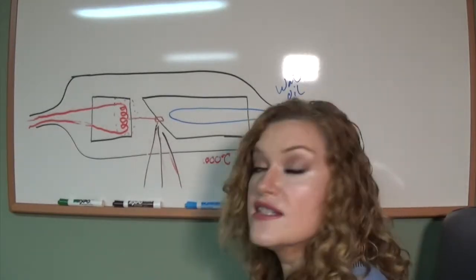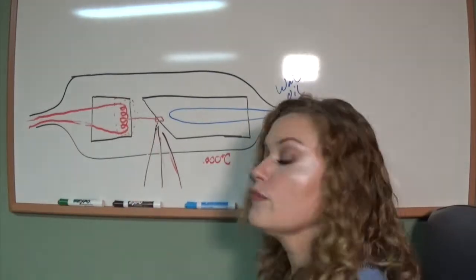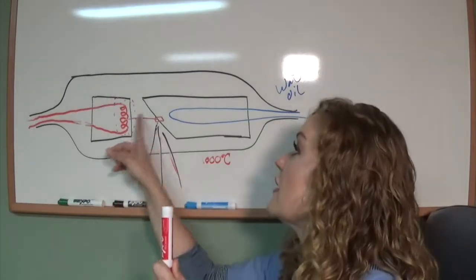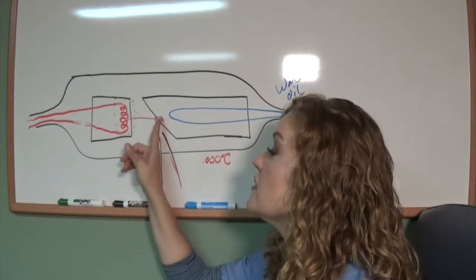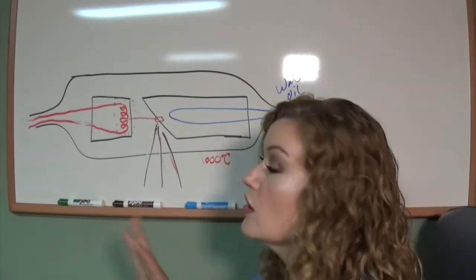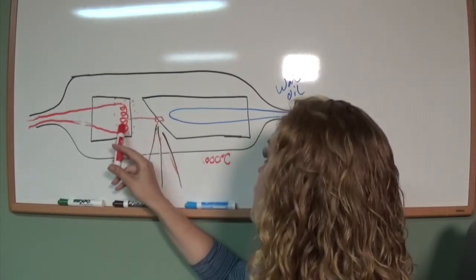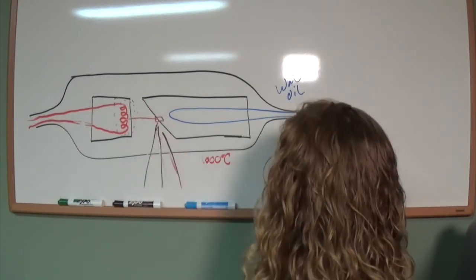The other thing we didn't talk about is the focusing cup. The purpose of the focusing cup is that it is going to be around the filament itself, because if this is the filament, this is the focusing cup, just like in the name, it's to focus the electrons, making them go one place. Instead of shooting everywhere, they need to go right to the anode target. So focusing cup is focused, that's where they're going to shoot. And that's nothing that you can control, it's just what's in the machine itself. So they're going to come across, have the focusing cup, the tungsten filament, and the tungsten target, and the electron is going to come across, shoot down, and then we make X-rays.